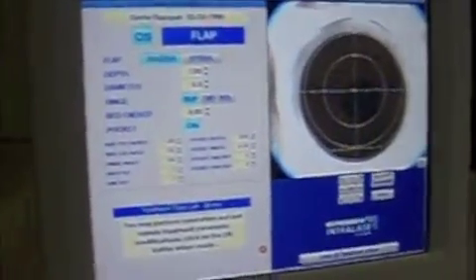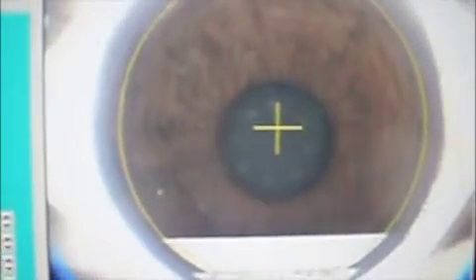This is docking, ideally right smack on the center of the pupil. These are the actual femtosecond laser shots being delivered on the plane of the cornea. This is the 120 micrometer depth level of the cornea. Those are small, very small bubbles creating a plane of separation within the cornea.